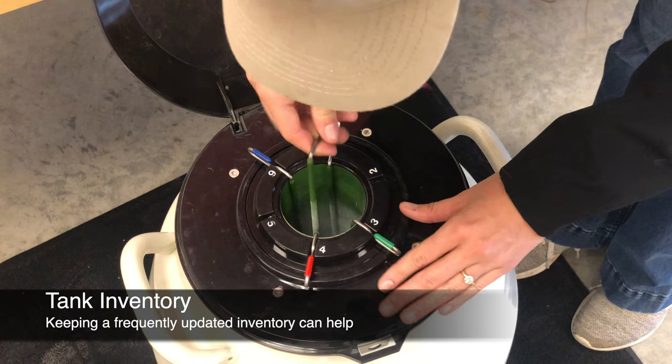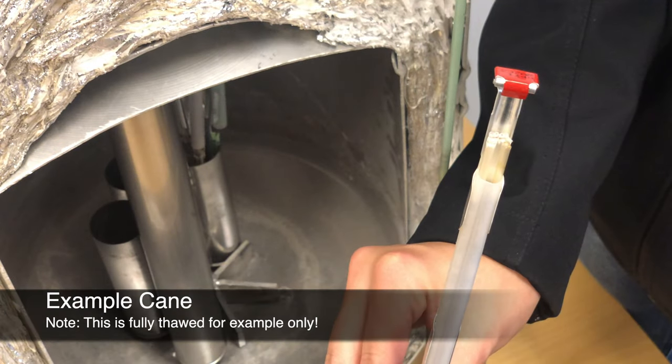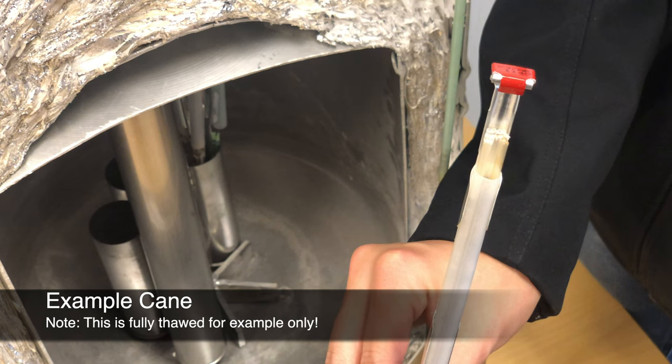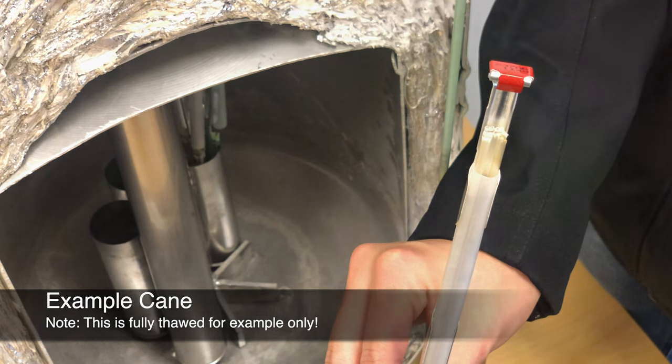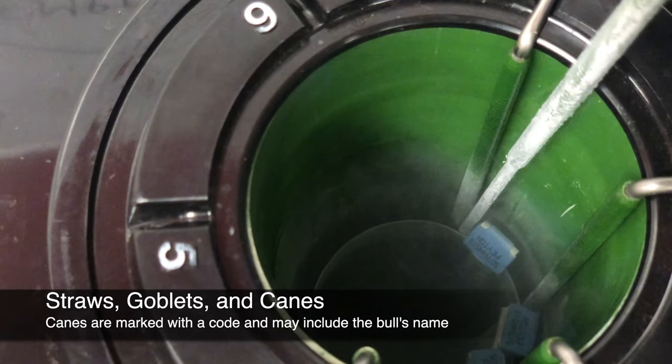This can help prevent repeated lifting and raising of canisters for identification. Semen is generally packaged in half or quarter cc straws, with five per goblet and two goblets per cane. The top of the cane is marked with the cane code to identify the bull, and it may also include the bull's common name.